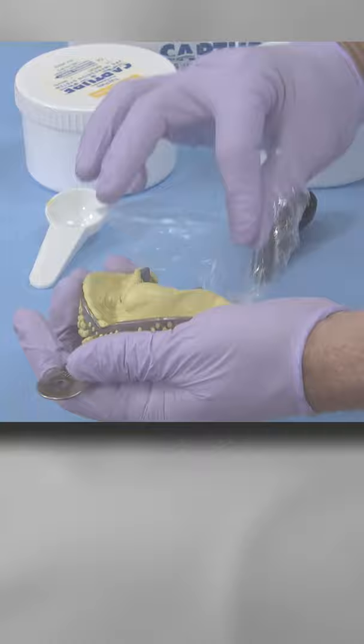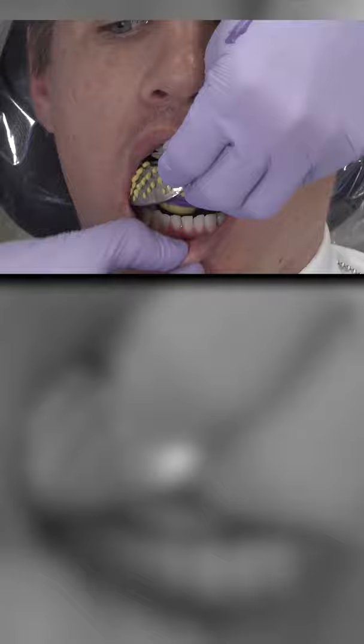Extrude the wash into the tray while keeping the mixed tip buried in the material to prevent air bubbles from getting trapped and forming pockets.